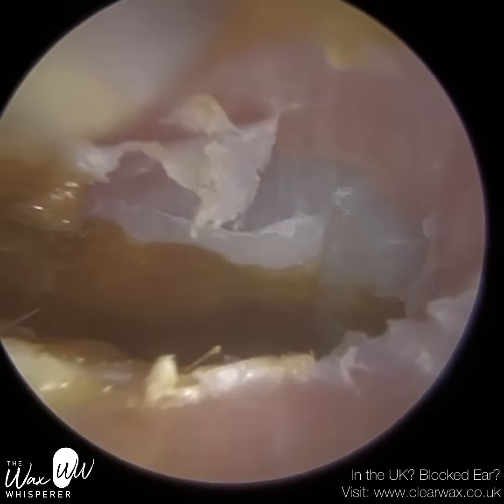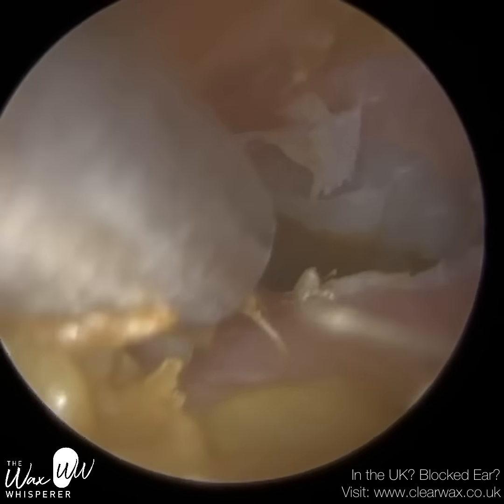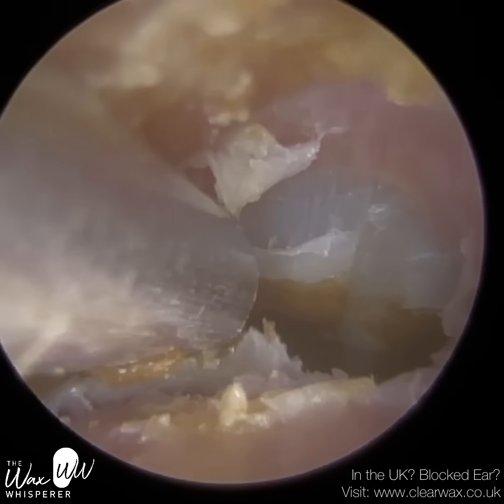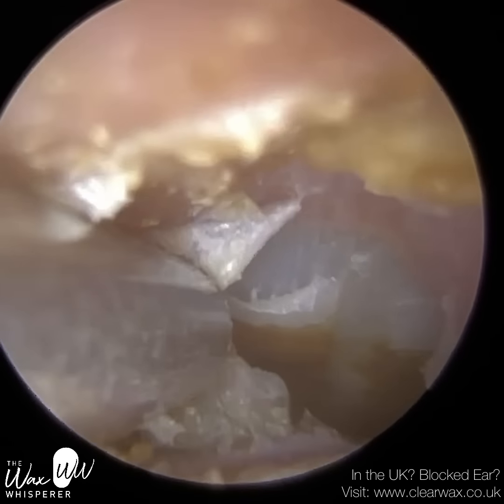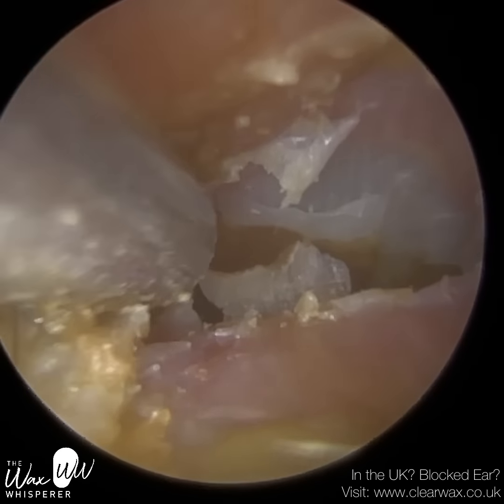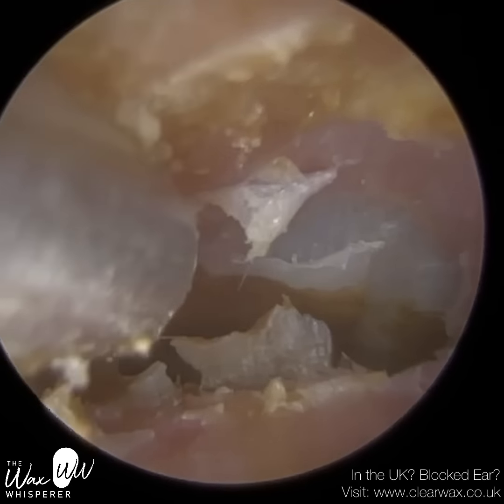There's a lot of swelling, a lot of edema of the ear canal, so you can see it's quite red and bulged, and we've cleared a lot of the debris. Now, this patient has got multiple layers of dead skin on their eardrum, and that's the tricky bit with the left ear to remove. So let's explain how the skin in the ear works and the function of the skin.